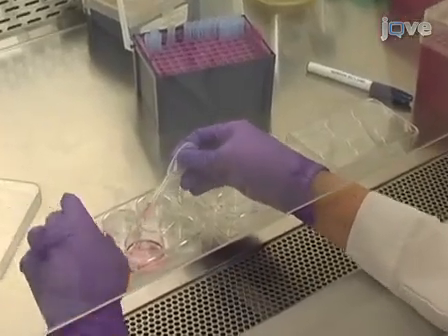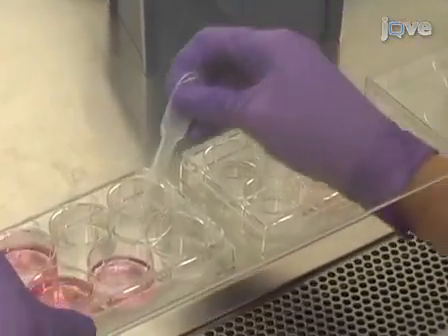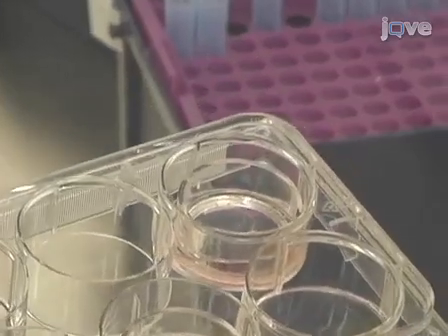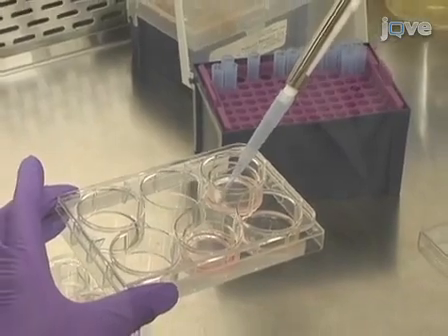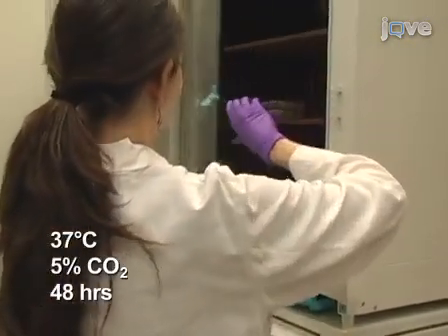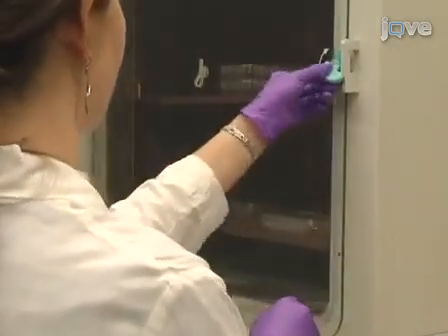Use the plastic Pasteur pipette with a cut widened end to transfer the slices onto the top of the filters, adding 1 to 3 slices per insert. Ensure that the slices are fully extended and that no liquid is covering them. If necessary, aspirate excess media with the pipette. Incubate at 37 degrees Celsius and 5% carbon dioxide for 48 hours.